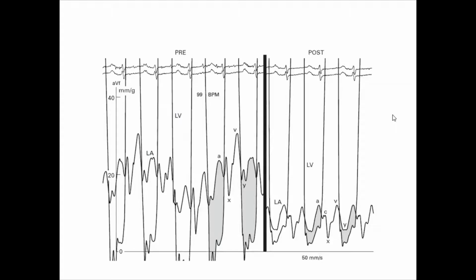We have a gradient. We have an ECG, which shows it seems in a sinus rhythm. Yes. Normal sinus rhythm. Good. Now describe the pre-procedure, then the post-procedure. Now concentrate on the pre-procedure. Okay. I can see the diastolic gradient between the LV and the LA. Okay, there is the diastolic gradient between LA and LV.